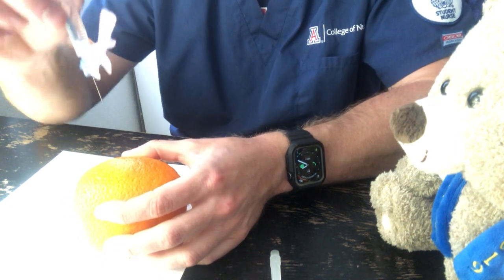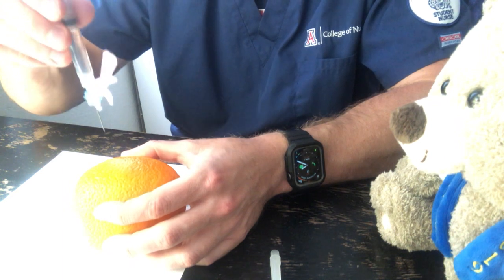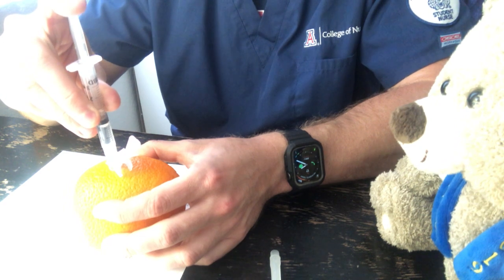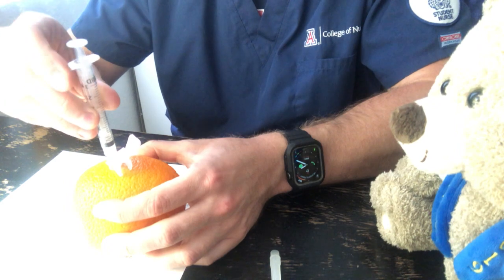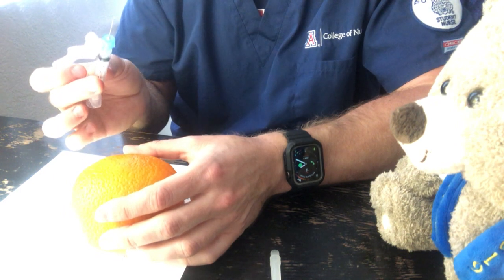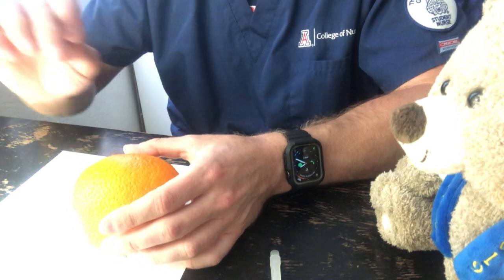I'm going to go in dart-like at a 90-degree angle and administer the medication slowly. And pull straight out. I'm going to engage the safety and put it into the appropriate puncture-proof sharps container. Never recap.